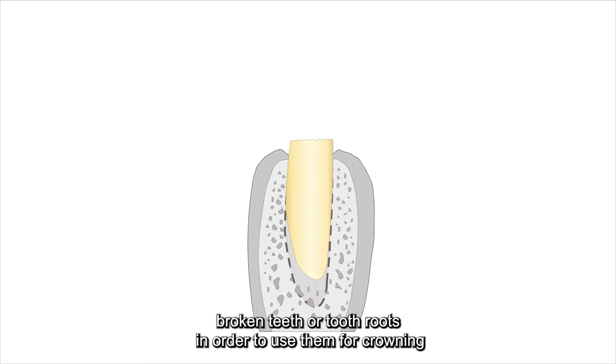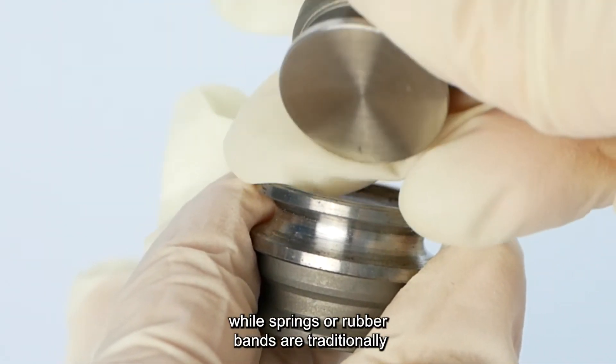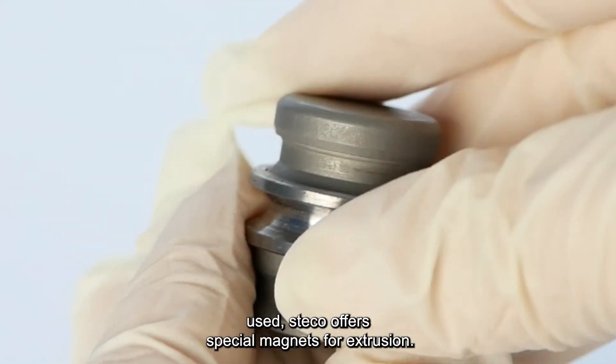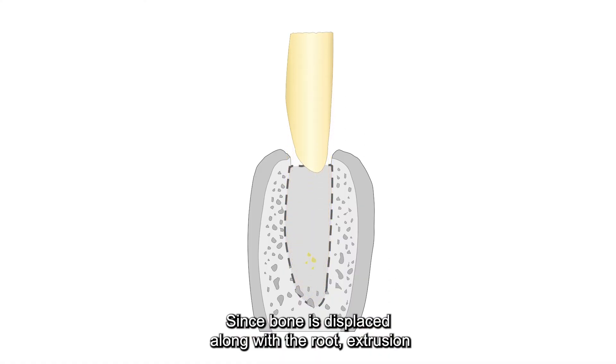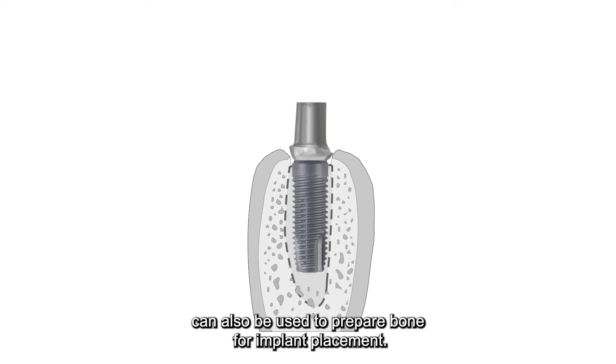There are various ways to extrude broken teeth or tooth roots in order to use them for crowning. While springs or rubber bands are traditionally used, Stecco offers special magnets for extrusion. Since bone is displaced along with the root, extrusion can also be used to prepare bone for implant placement.